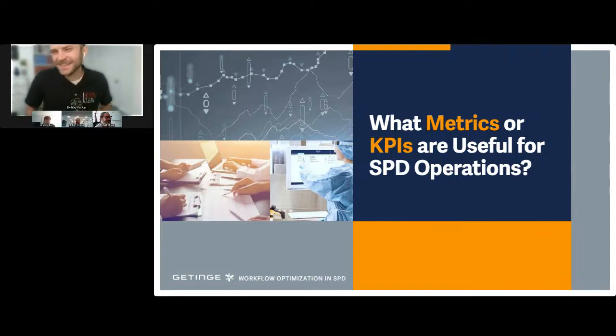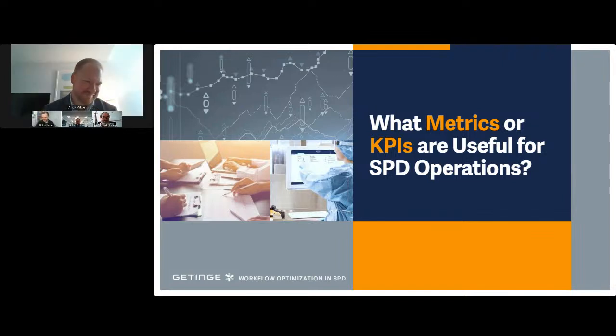So I will say data is extremely critical. You want to be able to measure a wide array of things, but for example, I'll focus on the decon process. You want to make sure that whatever you are putting through your decon process, it truly is coming out clean.